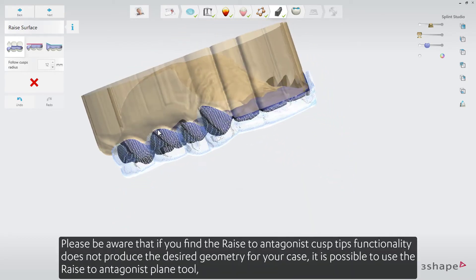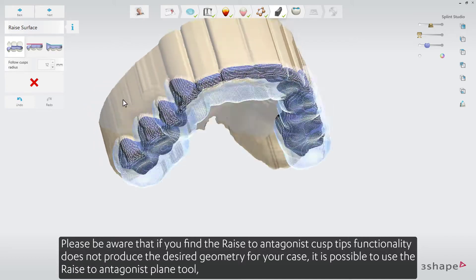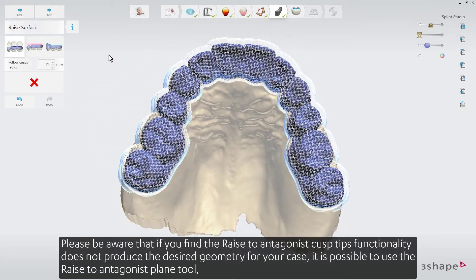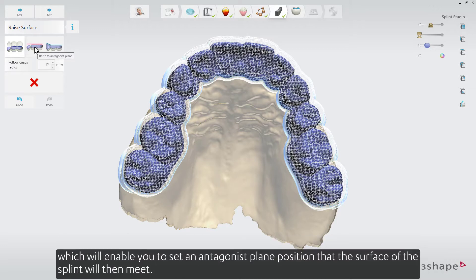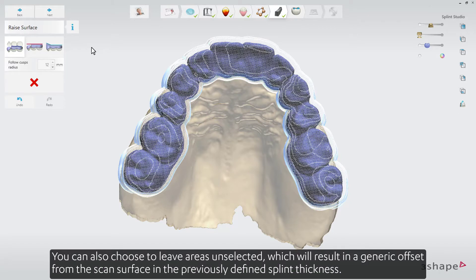Please be aware that if you find the Raise to Antagonist Cusp Tips functionality does not produce the desired geometry for your case, it is possible to use the Raise to Antagonist Plane tool, which will enable you to set an antagonist plane position that the surface of the splint will then meet. You can also choose to leave areas unselected, which will result in a generic offset from the scanned surface in the previously defined splint thickness.